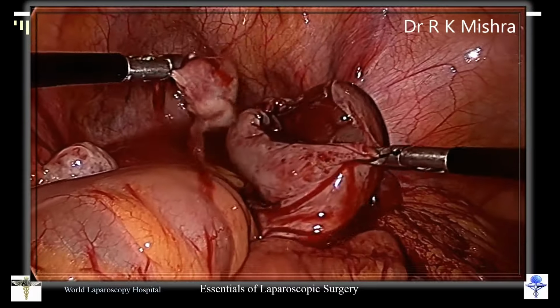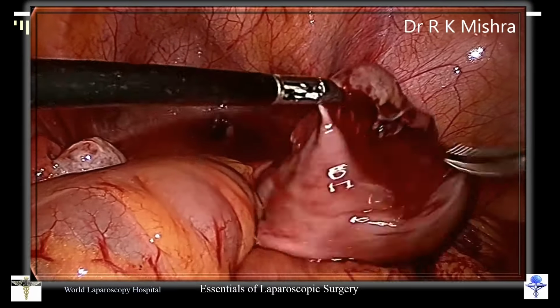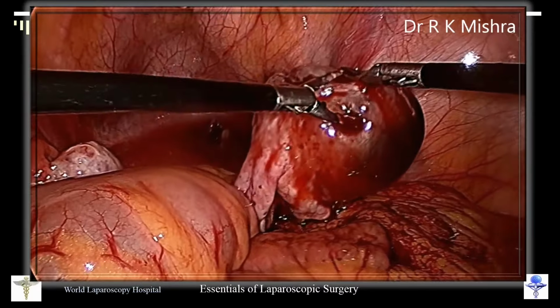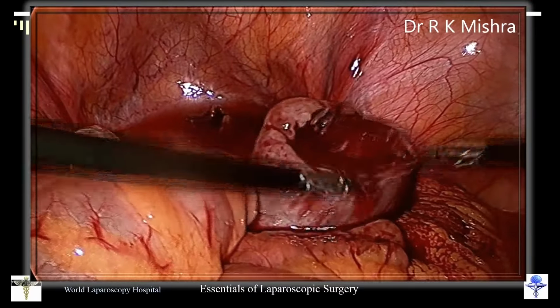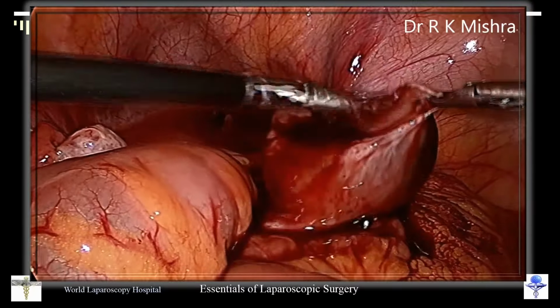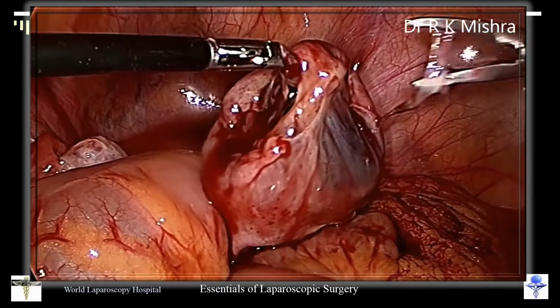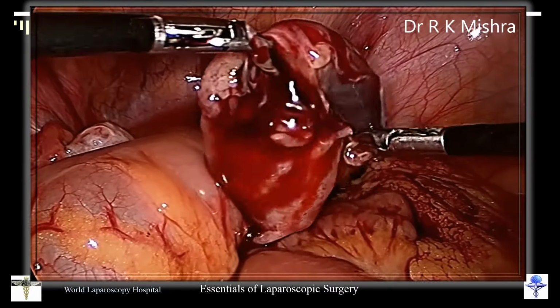This is more edematous due to the torsion part, and it is completely viable ovary. There is no sign of necrosis. Sometimes if it is completely necrosed, it becomes black, then there is no option, you have to do the salpingo-oophorectomy. Many young women come with signs and symptoms just like appendicitis, and once you enter you will see the severe ovarian torsion.